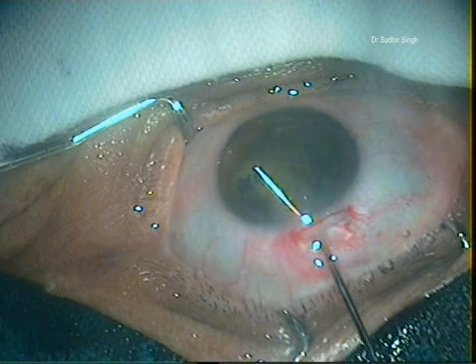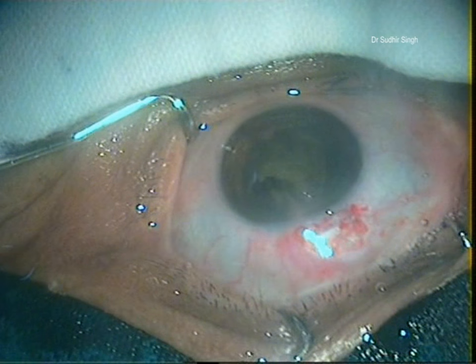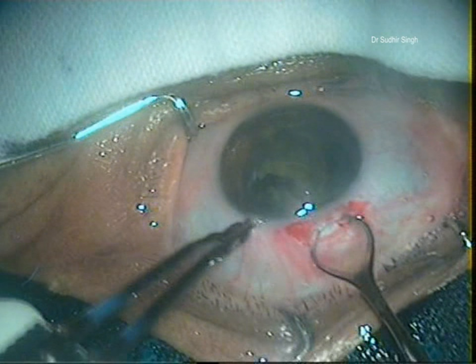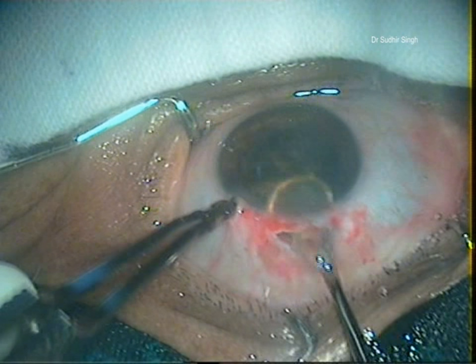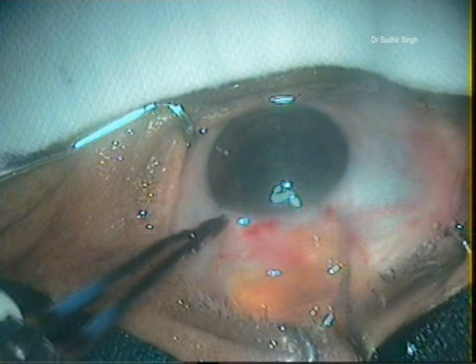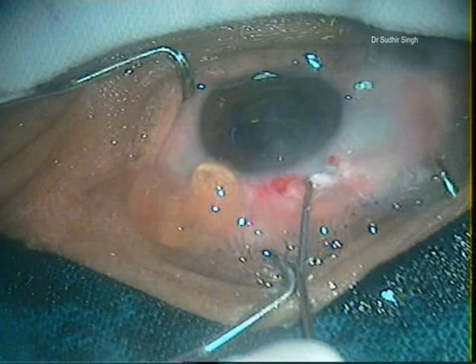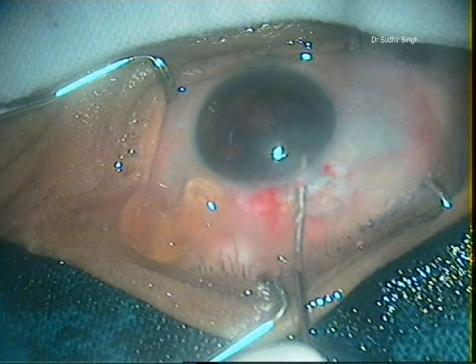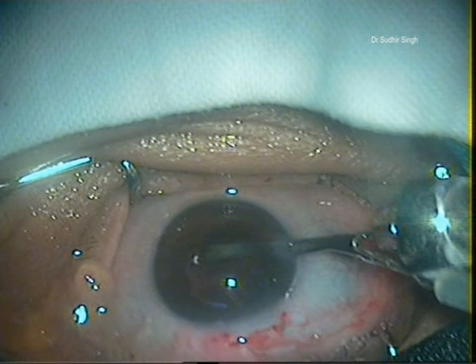Using viscoelastics, the engaged part of the nucleus is pushed back into the anterior chamber and rotated so that its longitudinal axis coincides with the longitudinal axis of the tunnel. The remaining part of the nucleus is engaged in the vectus and slowly taken out while the posterior lip of the tunnel is depressed. The remaining cortical matter cleanup is done with a direct 23-gauge Simcoe irrigating-aspirating cannula.